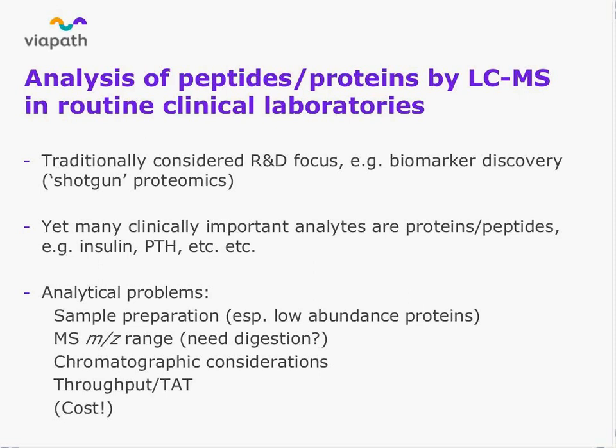Perhaps the reason why LC-MS for protein analysis hasn't yet reached the high throughput routine clinical laboratory is due to some of the analytical problems that exist. These are listed here. Sample preparation is one, but as you'll see, MSIA is going at least some way to overcoming that. The sample preparation, of course, is especially difficult and is relevant to proteins which are at very low concentration, and insulin is one of those.